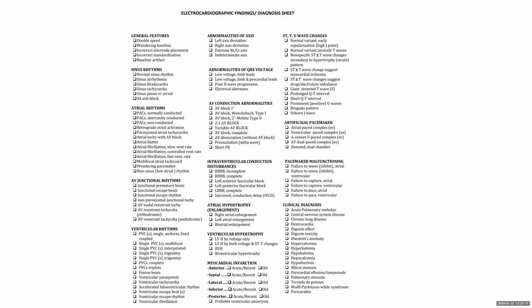Can we code sinus rhythm? That's a very good question. There is sinoatrial rhythm, which means the atrium is in sinus. In real life, we always teach that when you see complete heart block, you have to comment on the atrial rhythm. But the way it's in the code, when you say sinus rhythm, it means the ventricle is driven by the sinus rhythm. So I'm not sure that you can code sinus rhythm here because it would mean that the sinus is driving the beat. I don't know that for sure, but I worry that it might not count it as a correct answer.